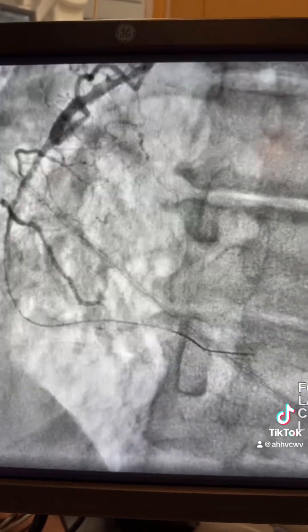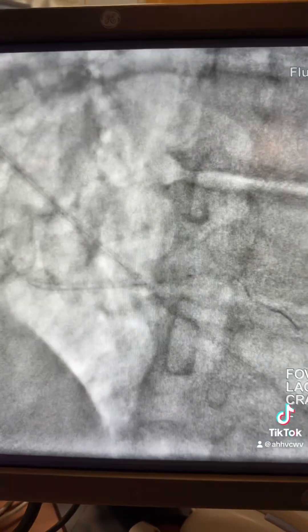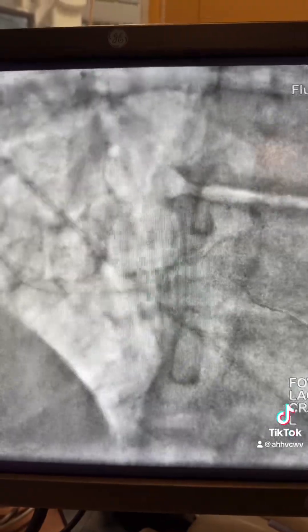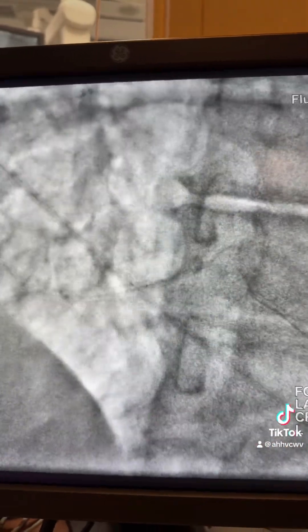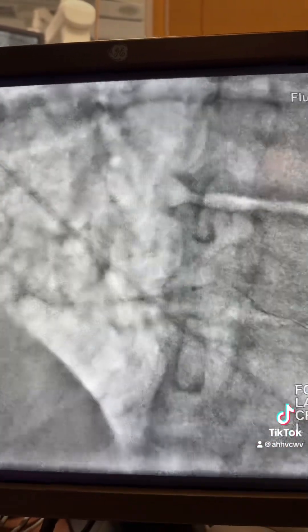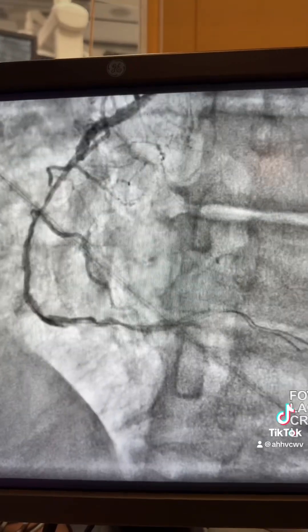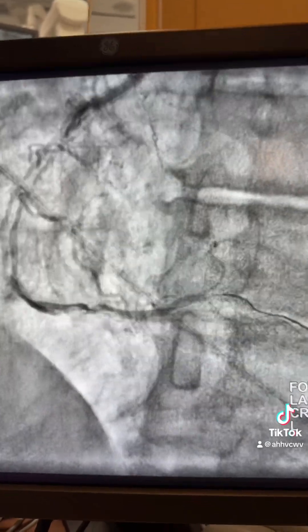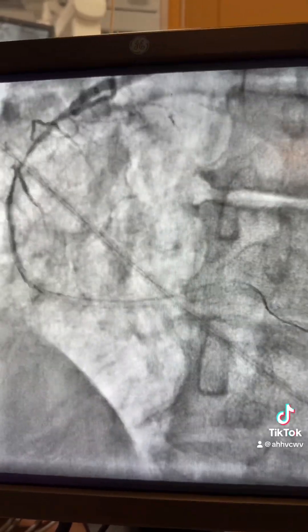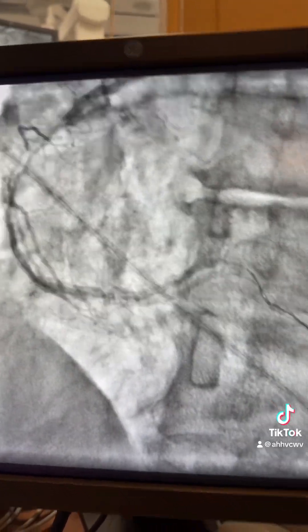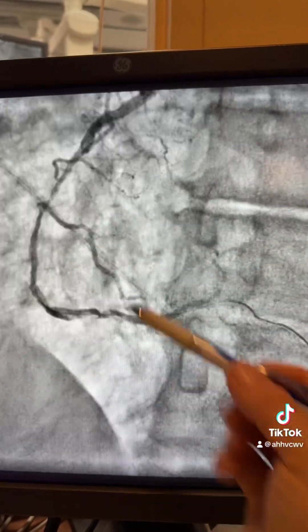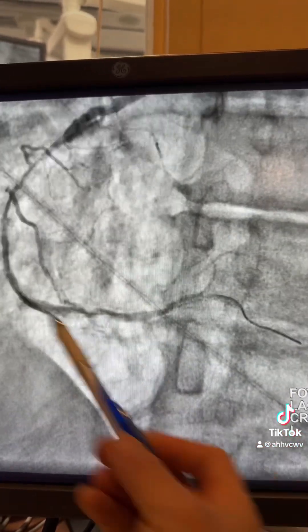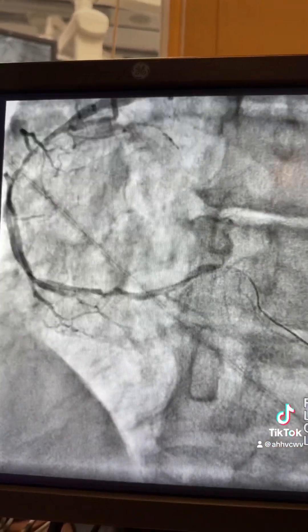We redirect the wire toward the PL and balloon the PL, so now we are ballooning the PL toward the RCA. Now you can see the true lumen. We can now stent this segment toward the RCA and cover the whole RCA.